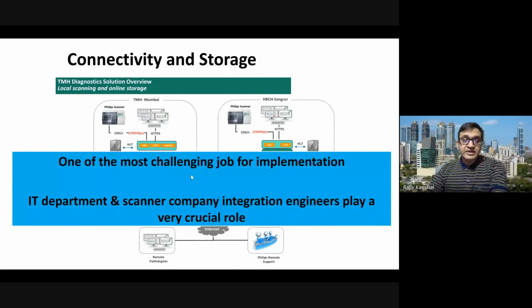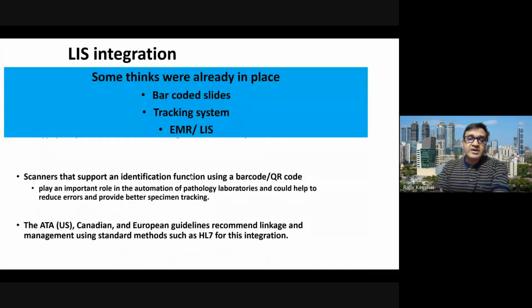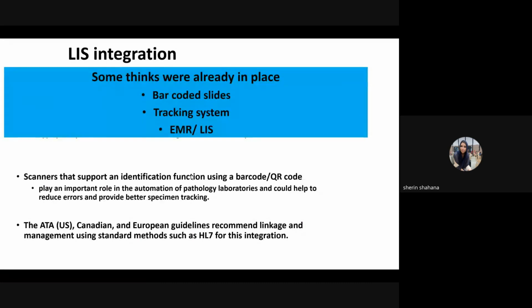The integration is one of the more challenging jobs which you have to face after the system is acquired. And this integration is very crucial because it makes your life very easy if the integration with the LIS is completely done. For this, at our lab, what is recommended is that barcoded slides should be used, so that they can be tracked easily. If you don't use barcoded slides, there is no use using this facility.